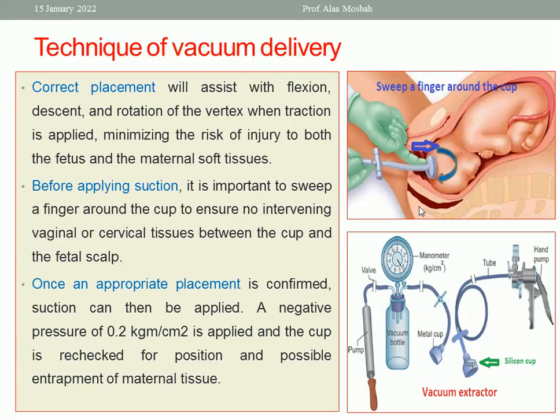Before applying suction and inducing the negative pressure, it is important to sweep the finger. Look at this picture, please. I'll move the finger of the other hand all around the cup.